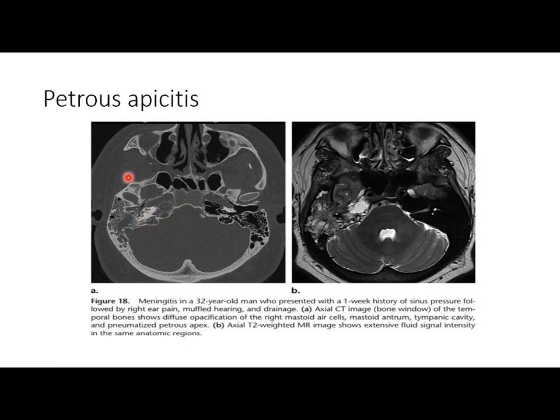This is the extension of the infection from the petrous bone, to the petrous apex, to the intracranial compartment, to the brain. It shows fluid signal intensity in the same position. It is a direct extension of this infection to the intracranial compartment and to the brain.